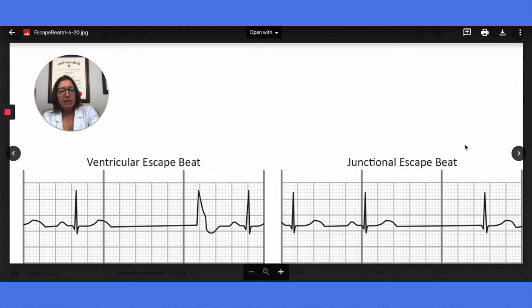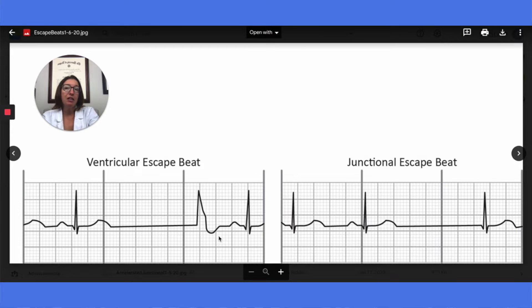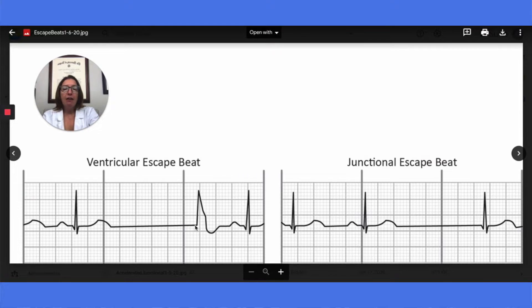An escape beat is an abnormal impulse that occurs after a sinus pause and occurs late. One example is a ventricular escape beat. A key characteristic of a ventricular rhythm is an abnormally wide QRS complex. With the ventricular escape beat, it is initiated in the ventricle. After the pause, the P wave will be absent and the QRS complex will be abnormally wide.